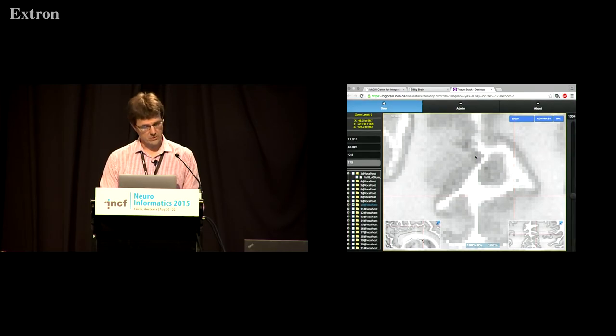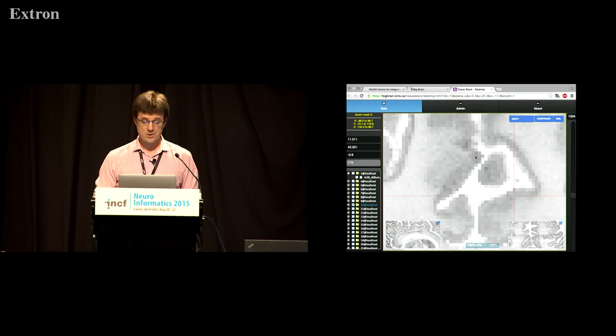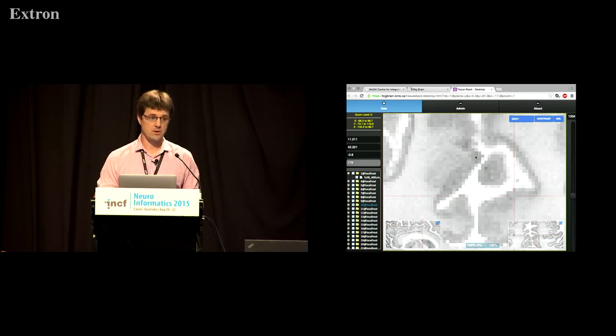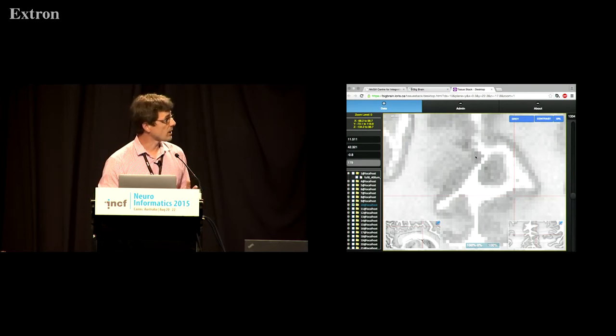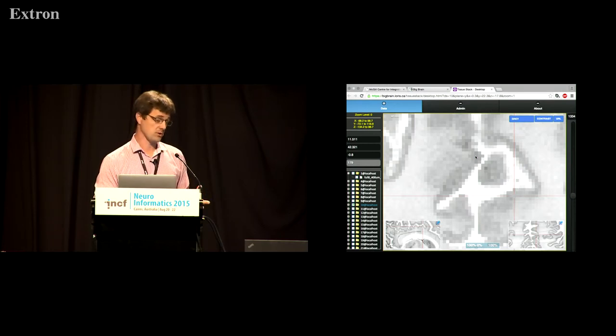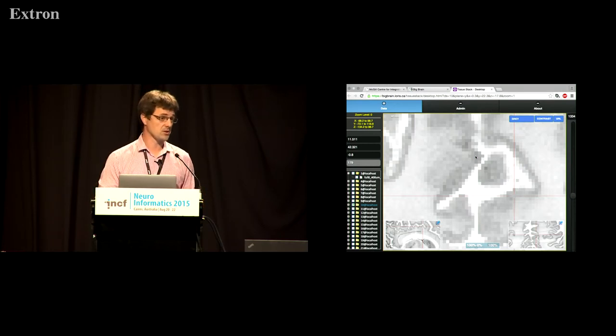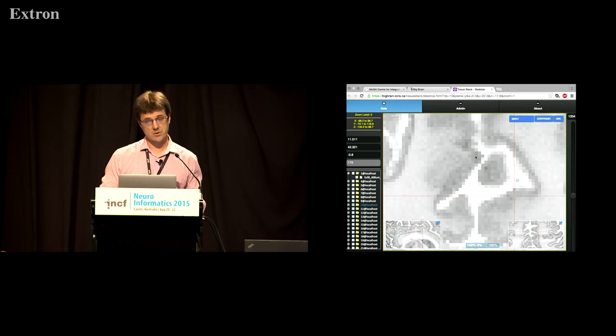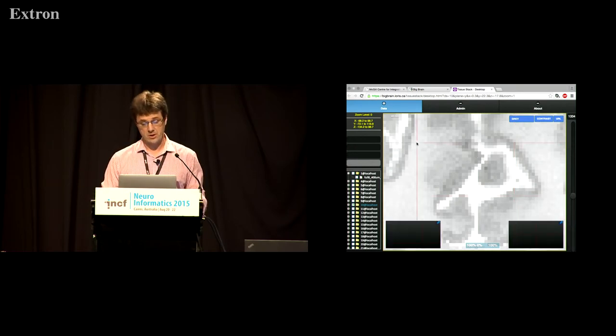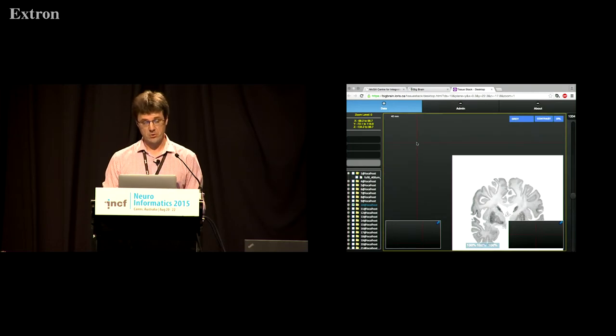This is a three gigabyte histology data set and it works quite well so we can zoom in and zoom out. The previous demos I was showing of all the mouse data we're running in a virtual machine in the Australian research cloud it's a single core vm. Tissue stack actually runs across a distributed apache cluster so if you have huge data sets you can make that work as well.